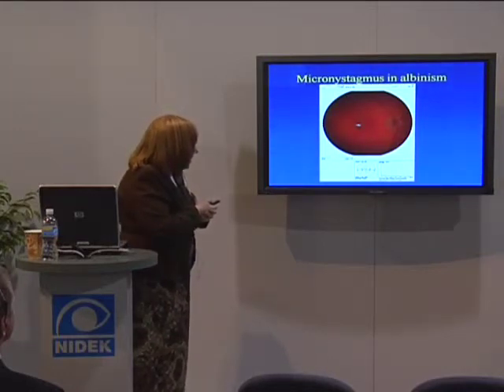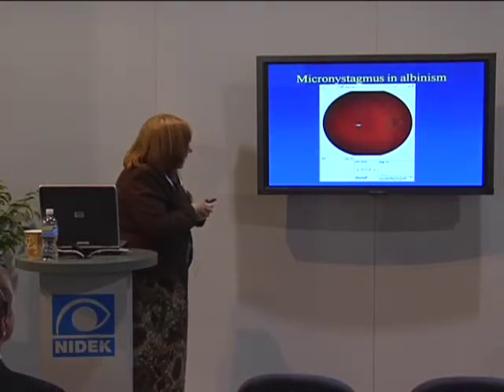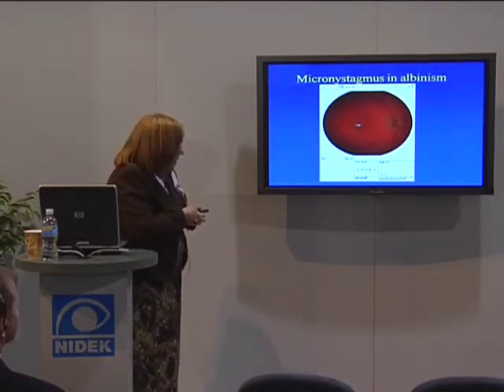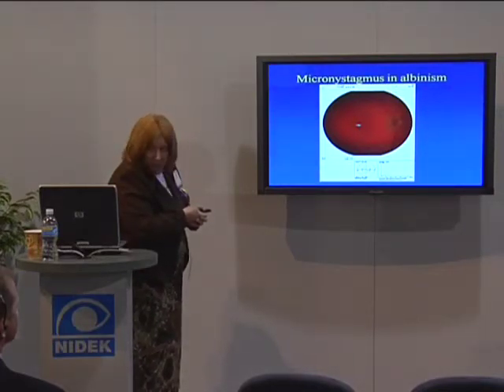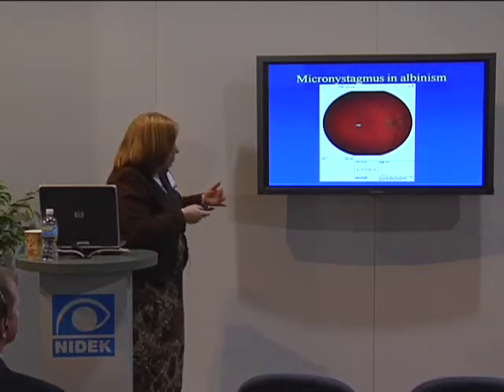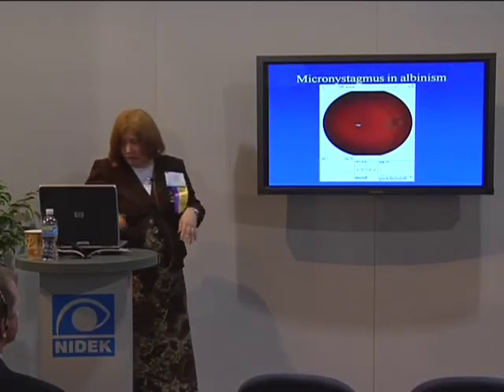And you could sort of see that his fixation sort of maps out along this line. And what you can generate also on the MP1 is, I forgot what they call it on there, a time map, let's say, of what happened to fixation. You can really see he had this real micronystagmus that you almost couldn't see otherwise, but it's very easy to map out on here.